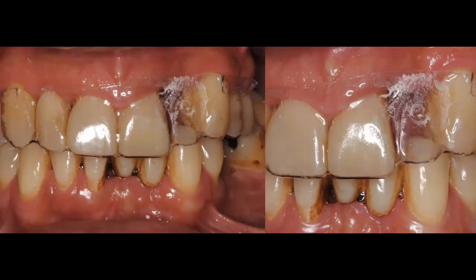So now you can figure out, okay, if I need to place an implant on this side, where would be the ideal implant location? And obviously, ideally, you want to be slightly lingual to the facial aspect of the tooth, so that your access hole is actually on the lingual. And if you decide to use a screw retained prosthesis, then your screw is going to be on the lingual side. Now, in many cases, depending on the location of the bone, depending obviously on the buccal lingual width, you're going to have to play with the location of the implant and where that access hole may be.